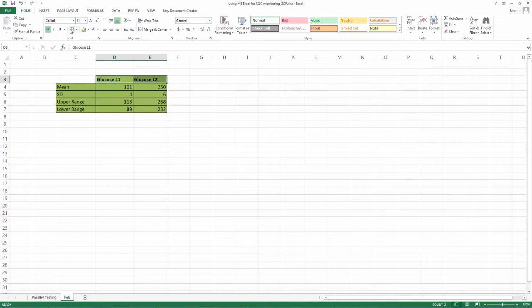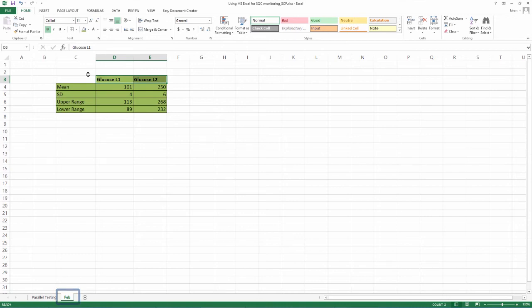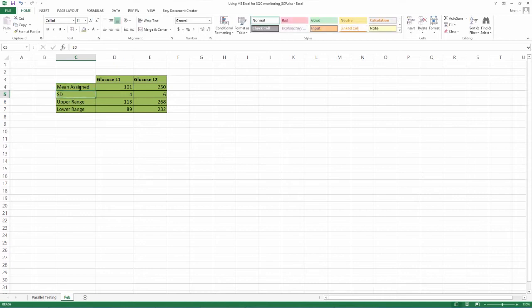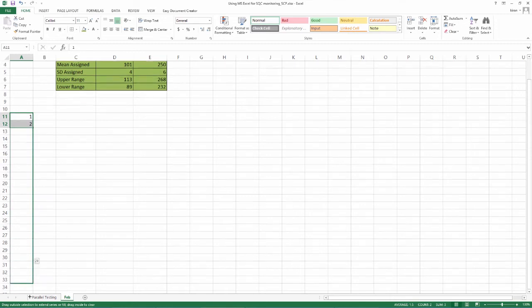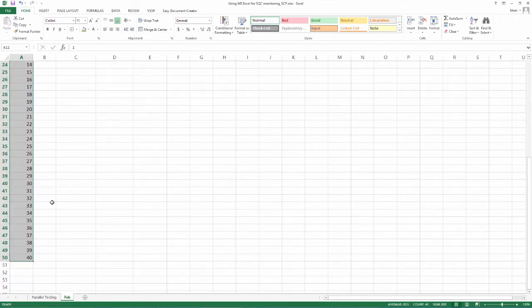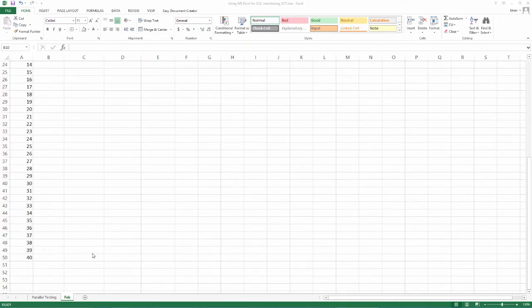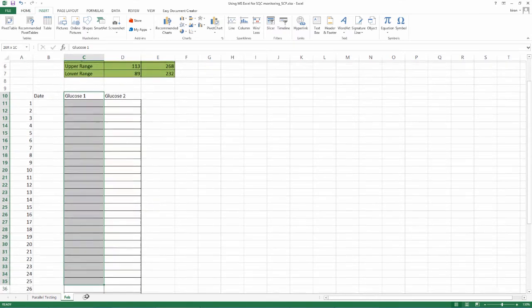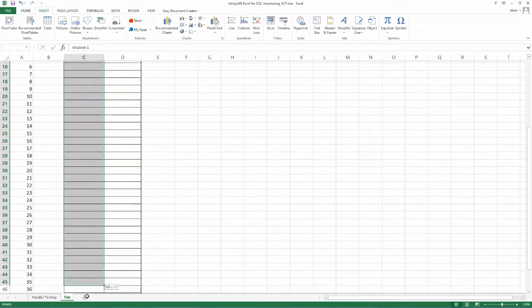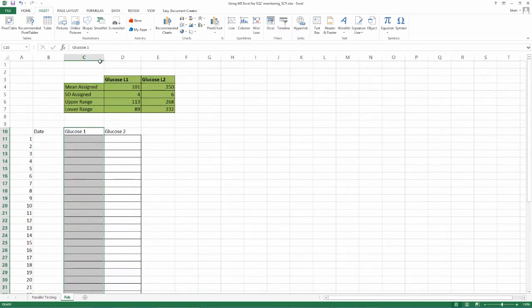Now, we have these numbers for our parallel testing for L1 and L2 of glucose controls. Let us transport these values to the sheet number 2. These numbers become your assigned values. Assume we are going to start using these charts from February onward. So, let us call this sheet Feb and transport these values there. Also, now that we are going to use these charts real time and we expect corrective actions, we should be having enough rows to do those. So, let us assign at least 40 rows for each analyte per month.